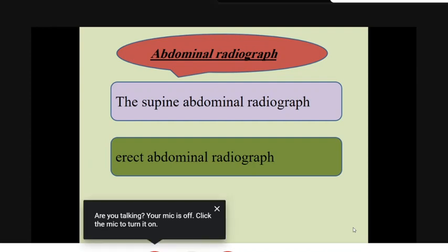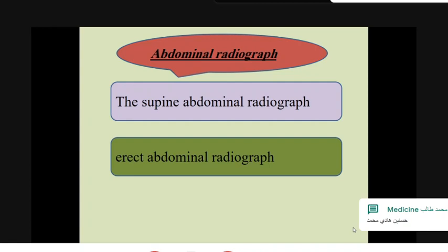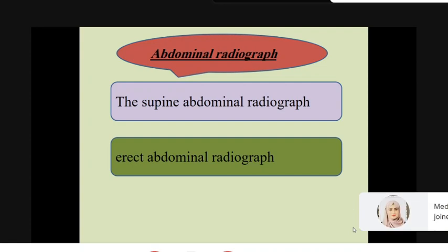A horizontal X-ray abdominal radiograph in erect position is frequently used. It can show the presence of multiple fluid levels and free gas and can add more information to diagnose the condition. So in erect plain abdominal film, we can see the air fluid level. In supine abdominal radiograph, we can see the caliber and the anatomy of the bowel.